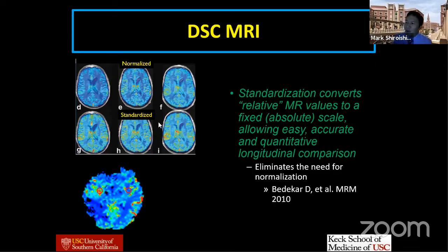Well, the method that we're using now uses standardized measurements, where a mathematical algorithm standardizes all the brightness values in all the MRIs so that you don't have to do this anymore. Obviously, when you do something like this, it can introduce a lot of variability in the measurements, because the radiologist might want to choose here or here or here. And then the normalizing region of interest on the other side could be anywhere. If they moved it over here or here, that ratio then changes.